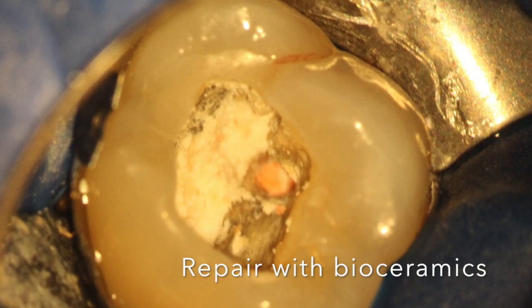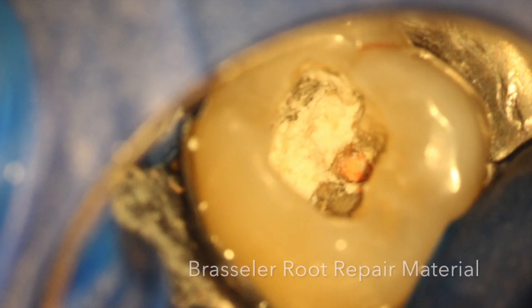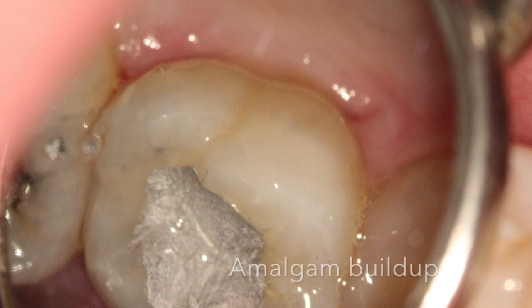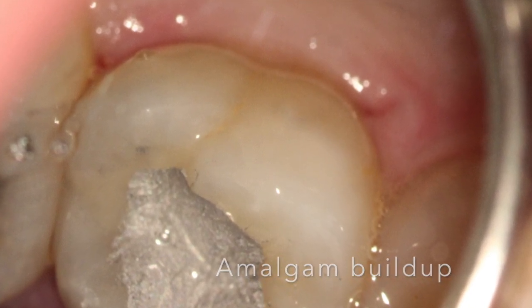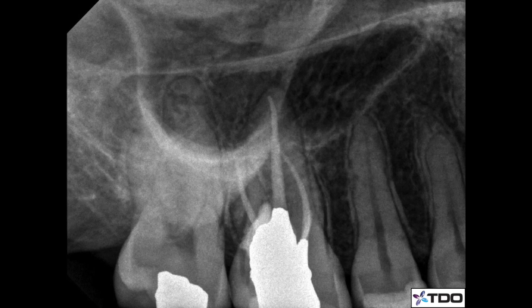The defect was restored with Brassler's root repair material. The buildup was amalgam. The tooth will be crowned carefully, leaving the distal area to be more cleansable during cleanings, and we'll continue to monitor this tooth. Thanks so much, and please leave me your comments.